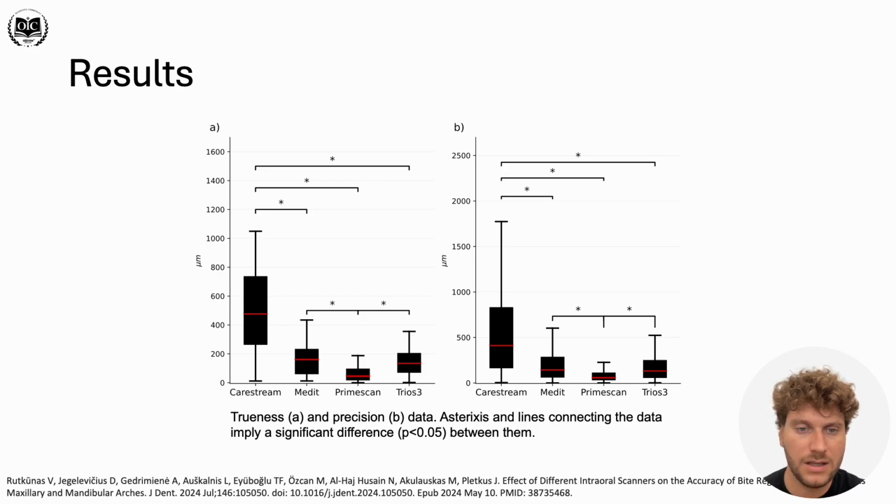But as you see, the Carestream performed the worst of the tested scanners, and this was due to the scanner's inability to scan metrological spheres well.